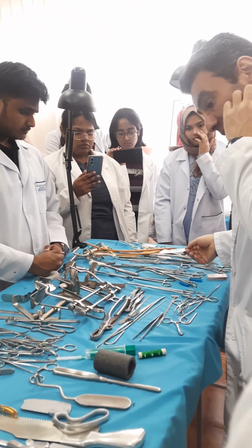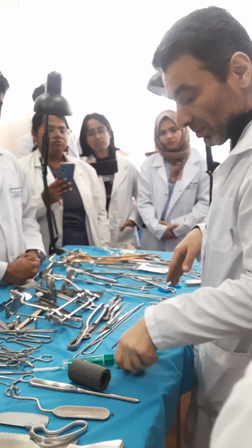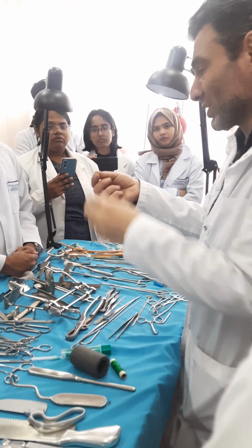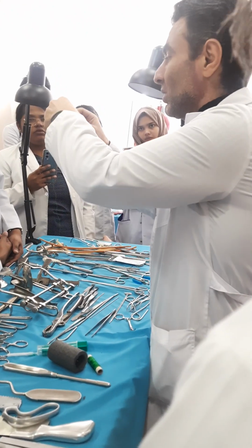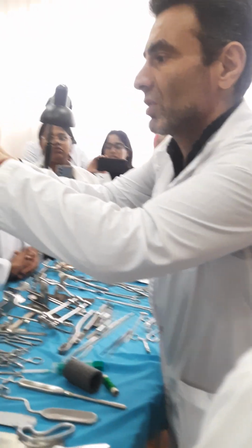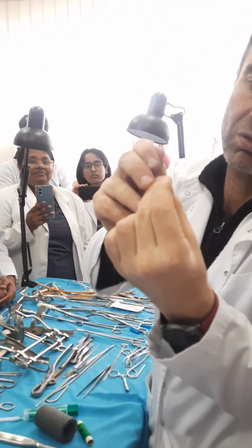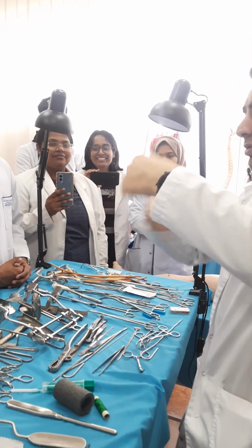According to it, all our threads we can divide into monofiber and polyfiber. For example, that is the polyfiber. Of course, you can say it's not medical. Doesn't matter. We have a medical one. Look, I disconnected it into the fibers. You see how many fibers it has. 3, 4, doesn't matter how many. There are polyfibers.